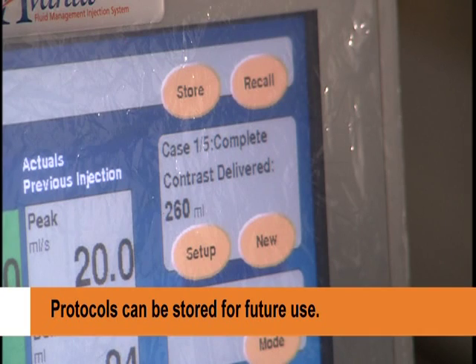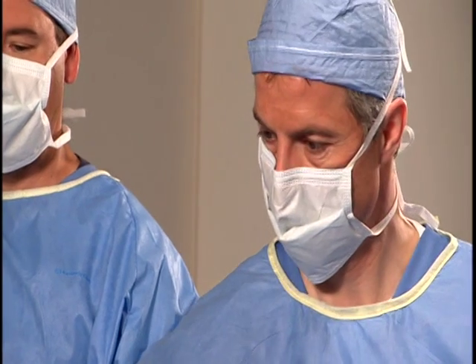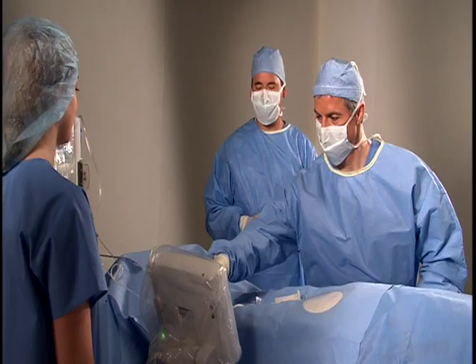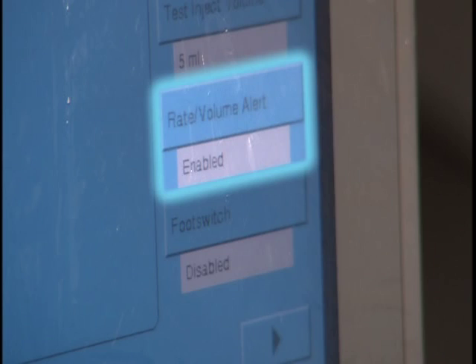An injection protocol can be stored at any time in the system memory for future use. For additional safety, the system can be configured to issue an alert when armed for high flow rate and/or high volume injection via the configuration screen.